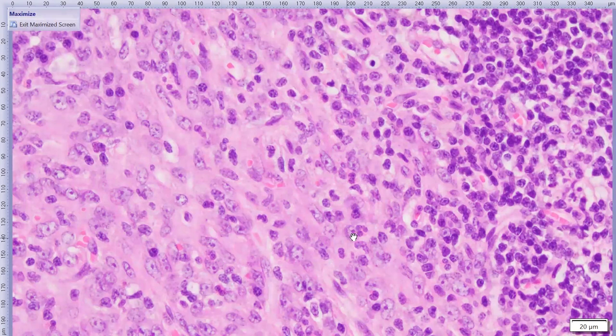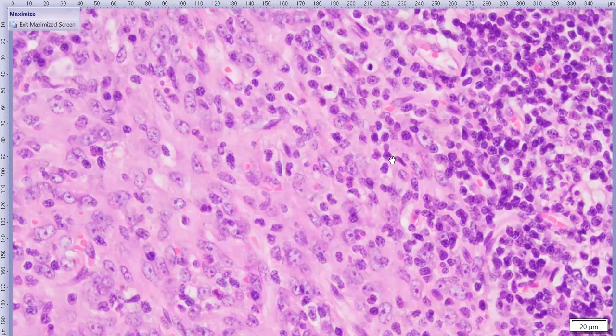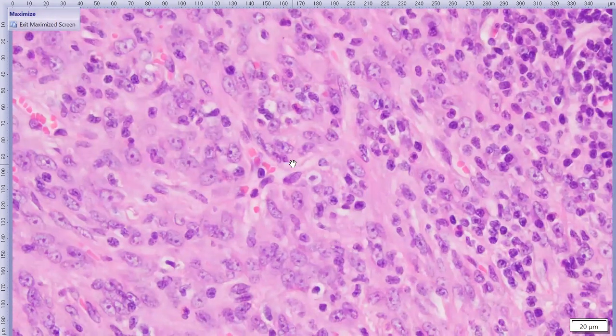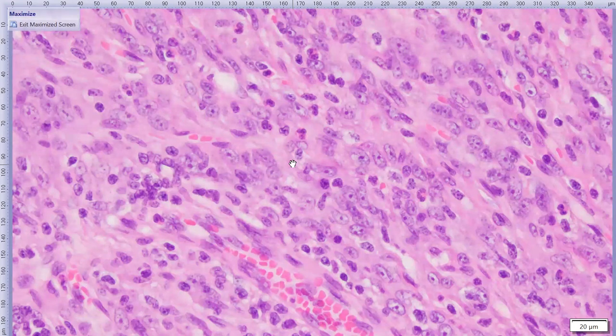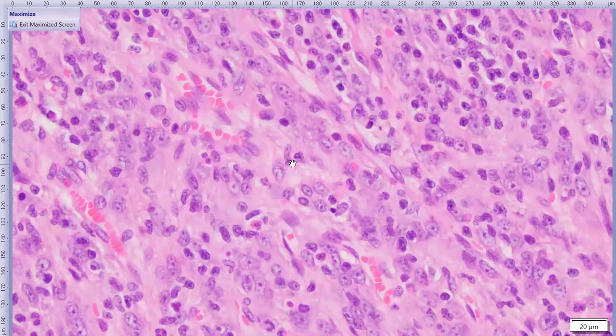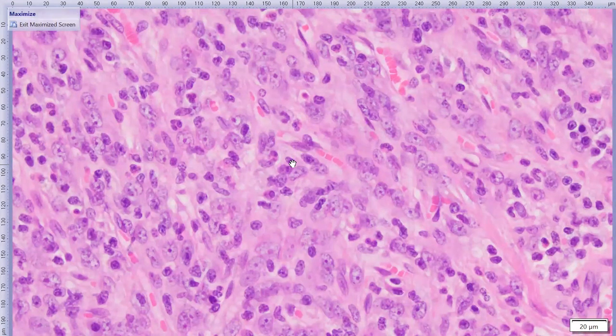And then we also have a bunch of eosinophils in here. So really everybody came out to party. And let's see if I can find a plasma cell in this one. They're probably around. This guy might be a plasma cell right there. But anyway, so there's mixed inflammation. I'd say the majority of the cells are actually these very plump spindle cells, which once again, I'm assuming are macrophages or histiocytes, depending on your point of view. That is essentially what this lesion is composed of. So we have very bland histiocytic inflammation.